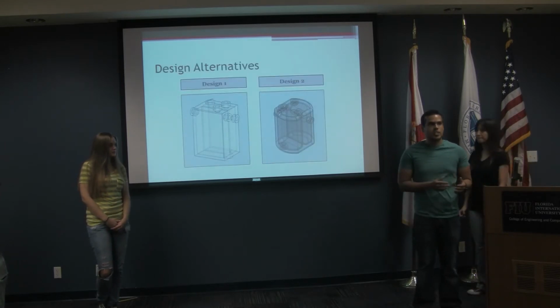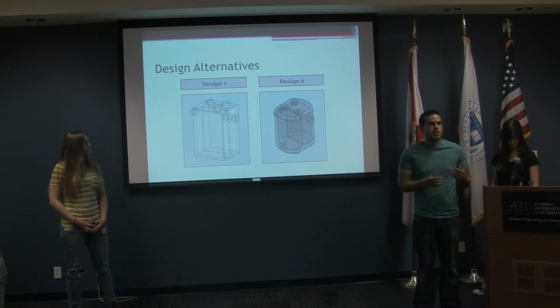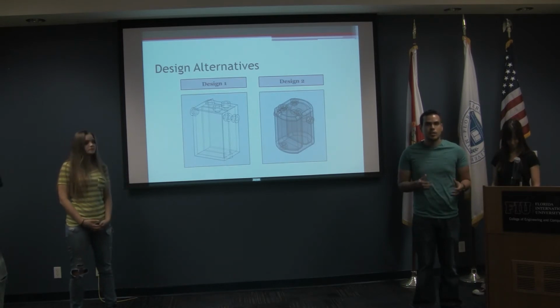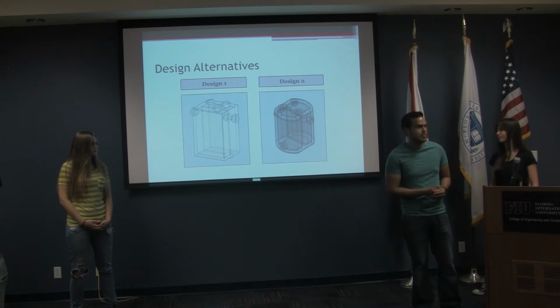And then our apparatus also needs to act as a monitoring system to monitor the temperature and the stress loading on the heart. So several temperature probes and stress loads would be added into the apparatus.